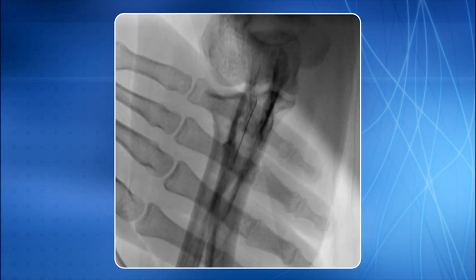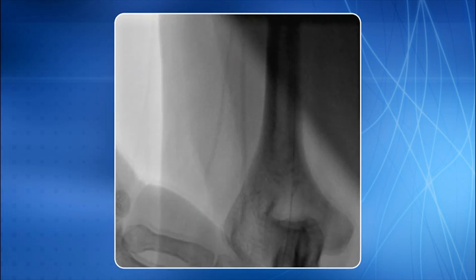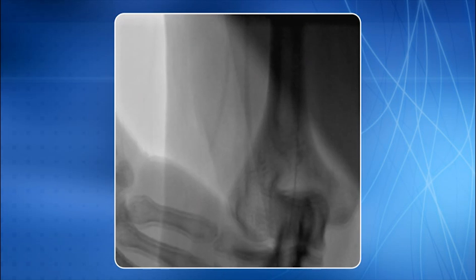In the last few years, we practice the technique which we have developed to tackle this perforation, and the technique has already been published in Journal of Invasive Cardiology in the year 2010. Now, I will show you systematically the steps of this technique. Once the perforation is documented, rather than stopping the procedure, you can continue with it.